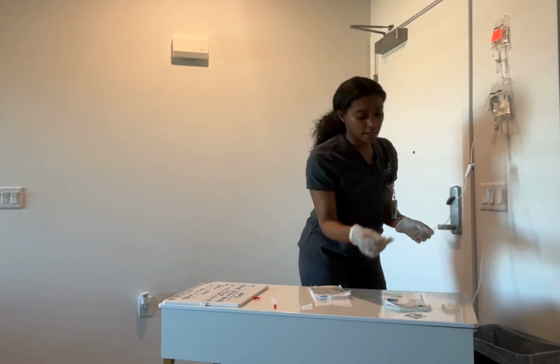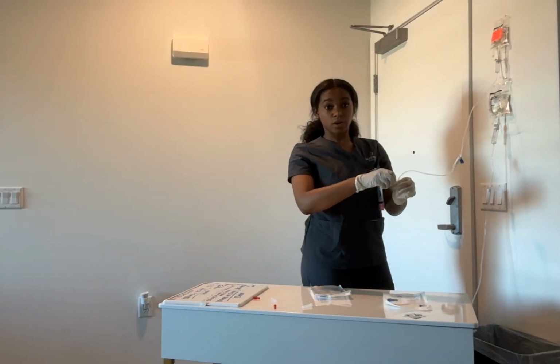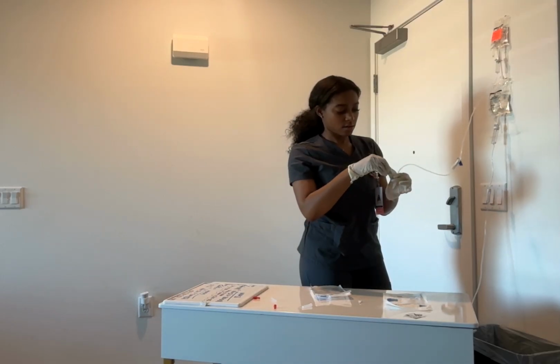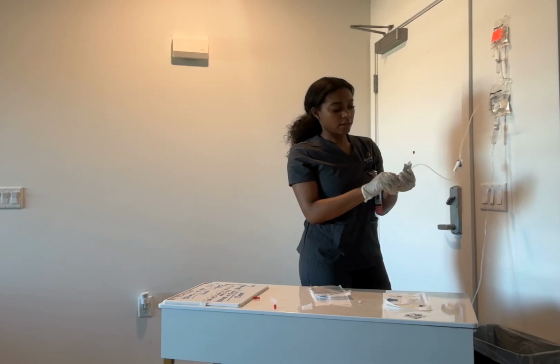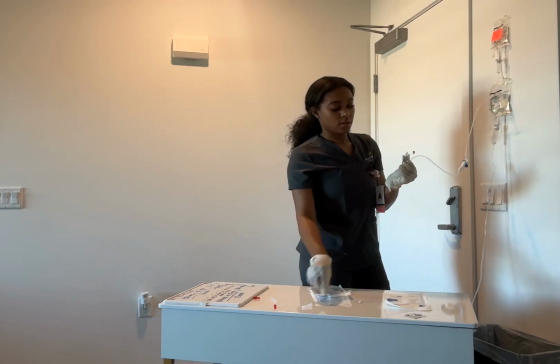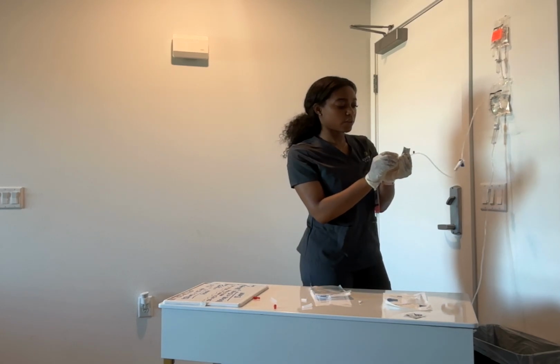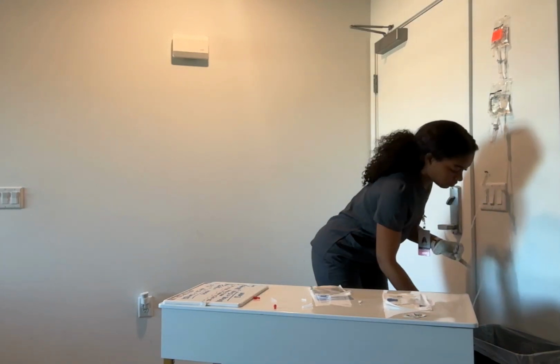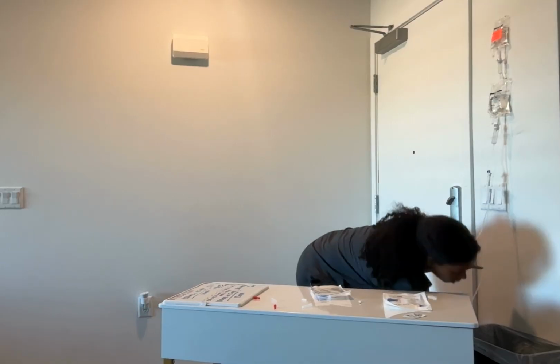And we're going to take our alcohol swab. And we're going to take the top off. We're going to clean this. Let it dry.